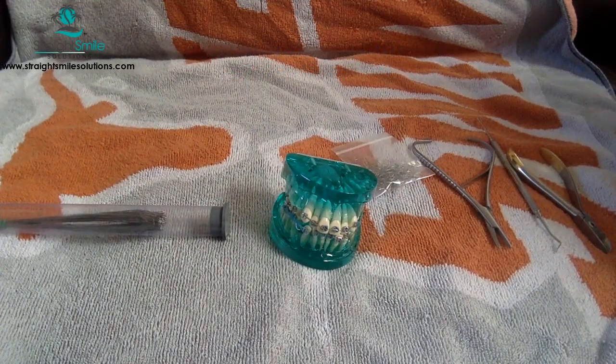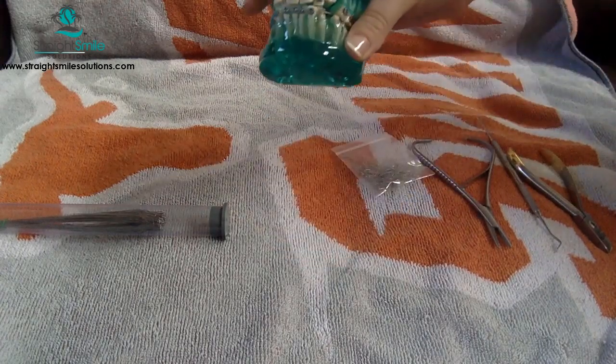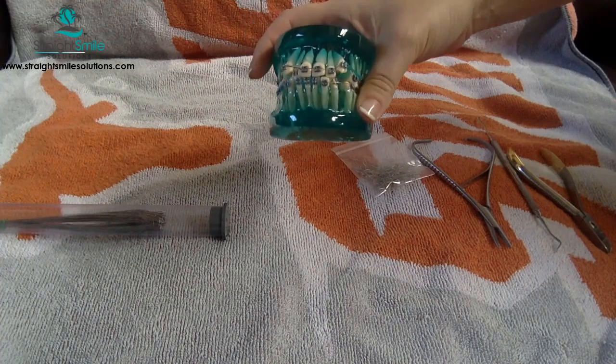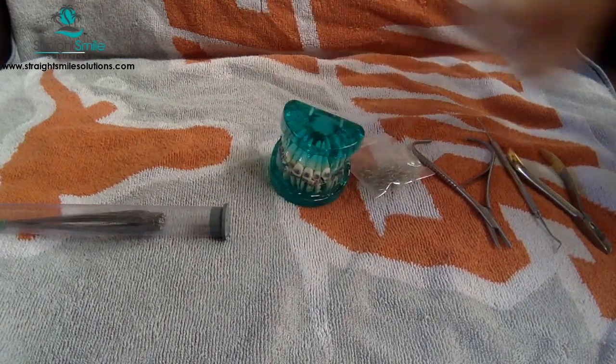Hey, this is Dr. Amanda from StraightSmile Solutions, and today we'll be going over stainless steel ties, or ligature ties: how to put on a ligature tie, and how to choose what type of ligature tie you need. Let me go over the armamentarium first.